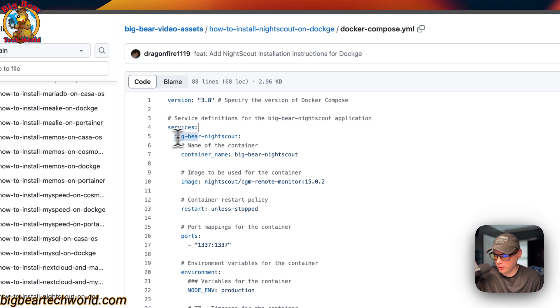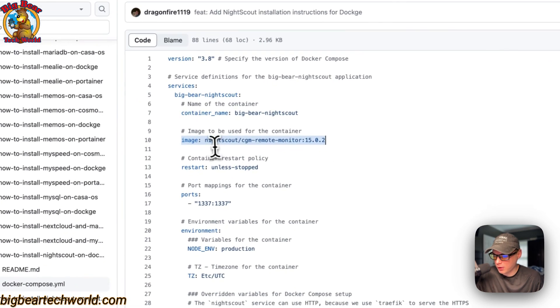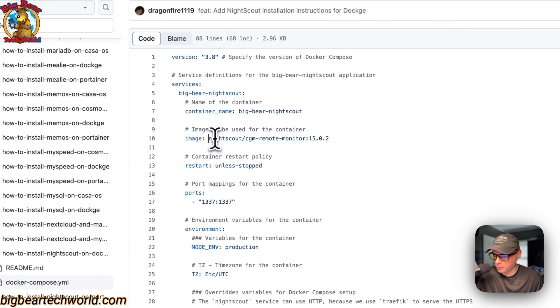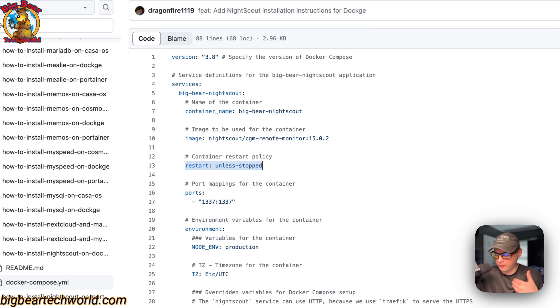The first service underneath services is called 'big-bear-nightscout.' The container name is 'big-bear-nightscout.' The image is coming off Docker by default since there's no URL prefix — this is the Docker image and this is the Docker image tag. The restart policy is set to 'unless-stopped,' meaning if you stop it intentionally it will not restart, but if it fails for any other reason it will try to restart.